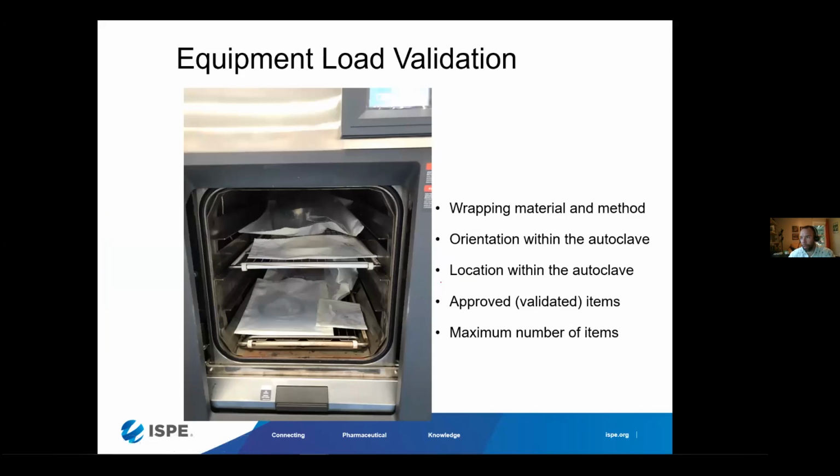And here, just a quick shot of an autoclave prepped and ready. All of these locations, the placement of equipment within the chamber is noted during the validation and is part of the routine processing per the protocols.